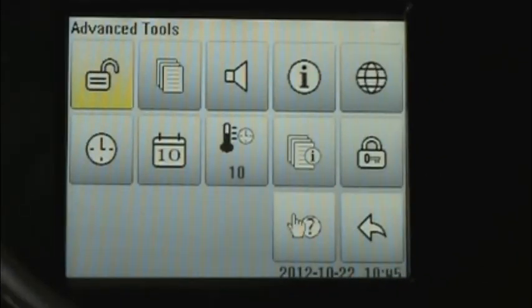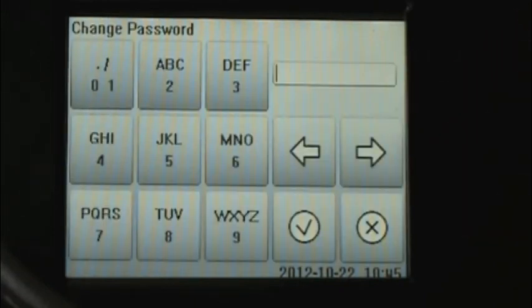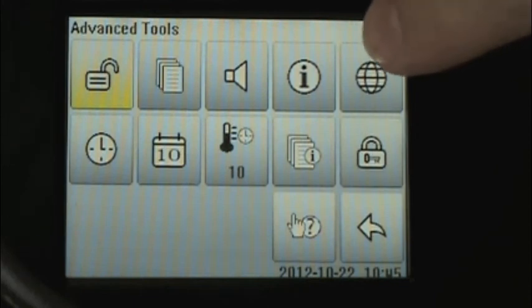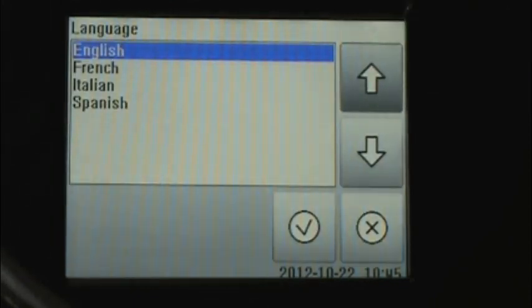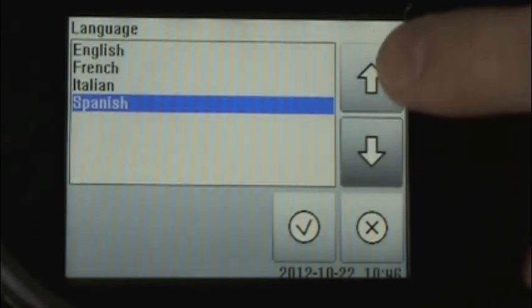From the advanced tools menu, we can change the password, and this is something a supervisor will want to do when they're initially setting up the incubator. We change the password by pressing on this lockbox icon, and now we're prompted to enter our new password. Another item that you'll want to do when you first receive your incubator is select the appropriate language. This globe icon allows us to toggle between English, French, Italian, or Spanish.